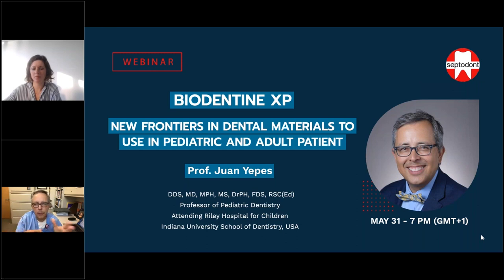So I know for the person who asked this question, I wish I had an answer of, okay, 2 millimeters or 3 millimeters or 4 millimeters. But each situation is different. I don't know how many times I have talked with Aurelie and with colleagues about the same question, how many millimeters you need to remove. And I don't think anybody will tell you exactly how many millimeters. You remove a little bit.